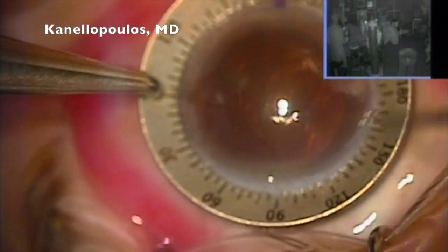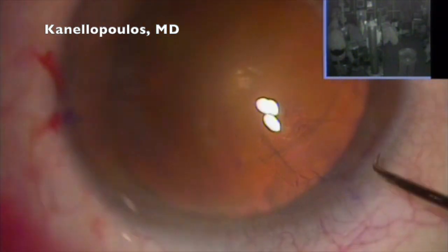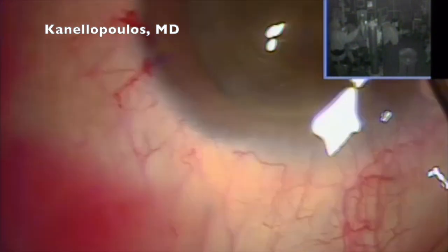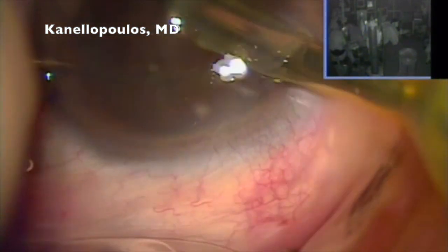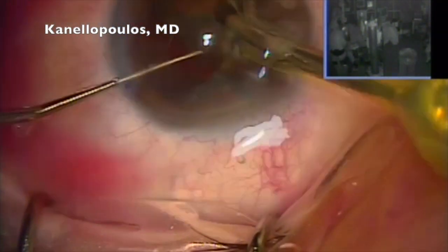Next case again — a T4 at 14 degrees. Our go-to lens is the Aspheric Akersoft Toric. Being consistent through these whole years, I think, is one of the biggest assets of an experienced surgeon, because then every parameter makes sense and you can base your results on those parameters. My incision is always at 135. You saw me marking, you saw me using the 6 o'clock again — that looks here as if it's 12 o'clock since I'm operating from the head of the patient. Again, divide and conquer with the Signature device.